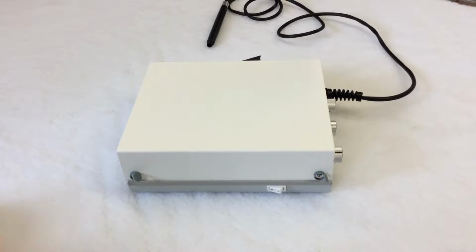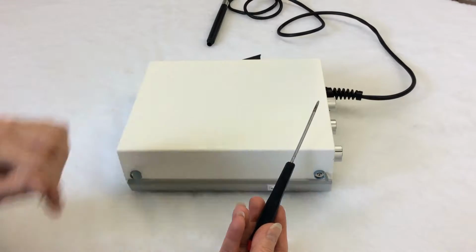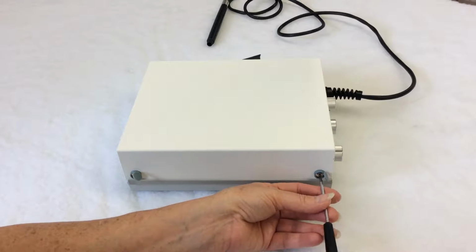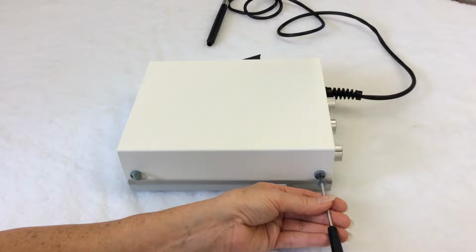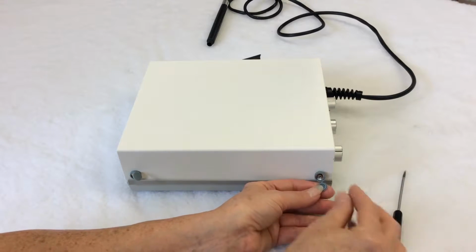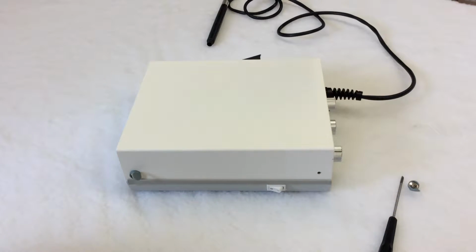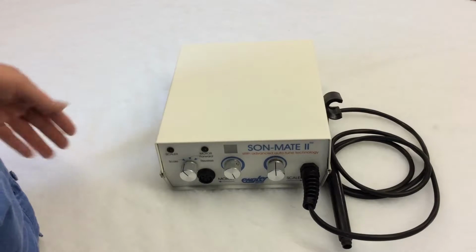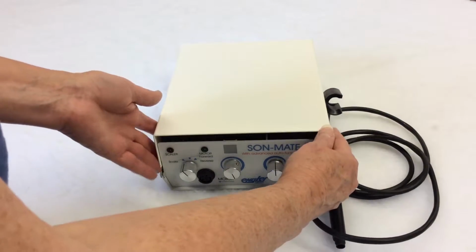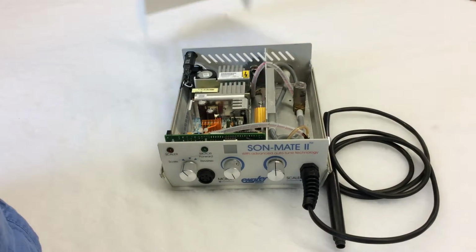When you have opened all 4 caps, take your screwdriver or Phillips and remove the screw and the cap together. Put them in a safe place because you will be needing them again. Next, you carefully pull the top cover, starting from the front, and lift towards the back, removing the cover completely and put it out of your way.